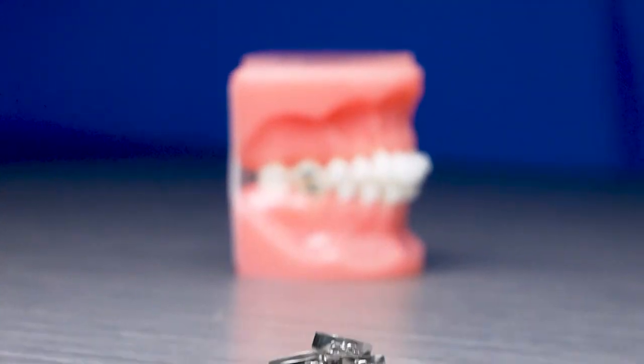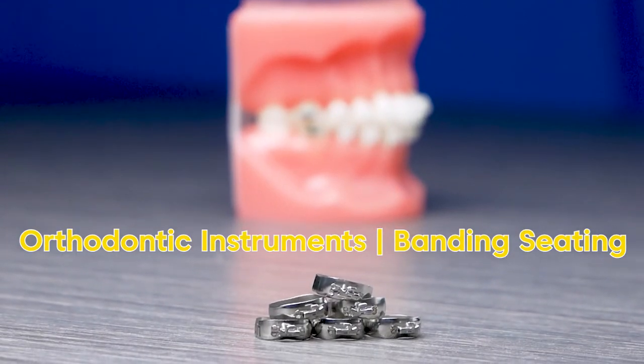In this video, you will learn about the tools an orthodontic assistant uses to apply bands to your teeth.